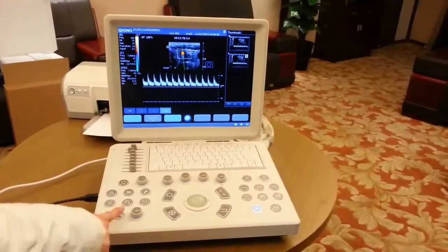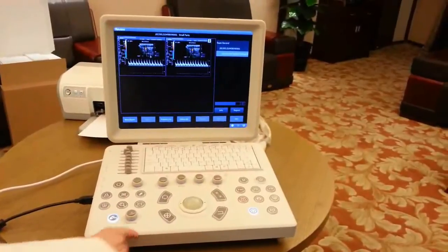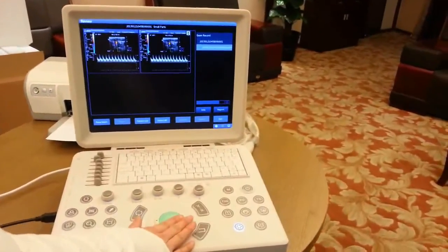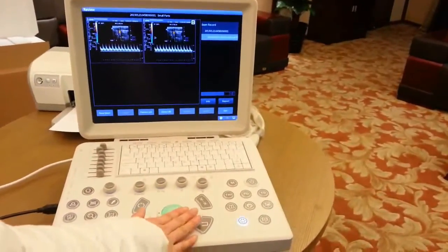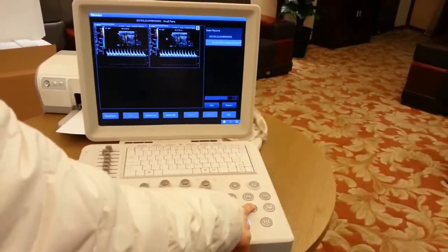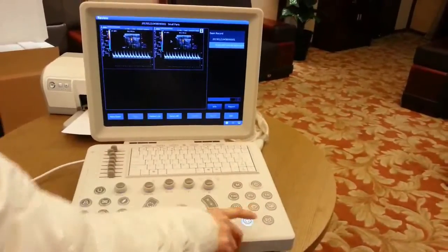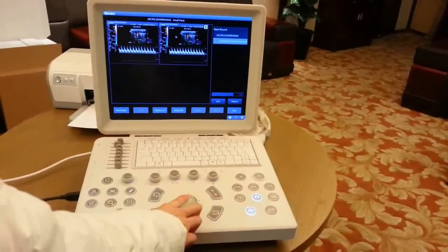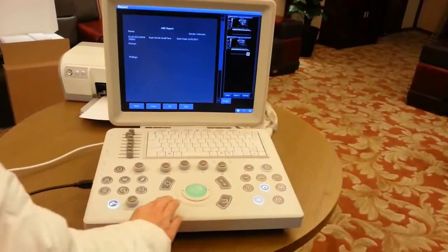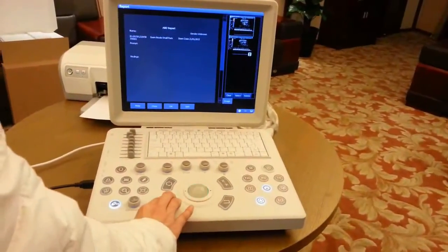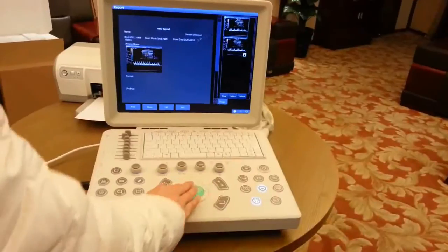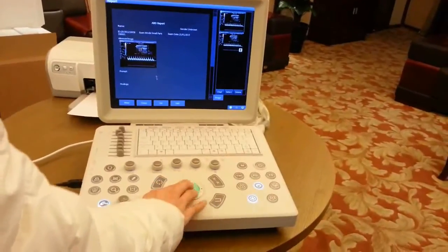Press the review button to review all saved images and cinemas. Press the report button to enter reports. You can then choose one image and edit it, and then print it.